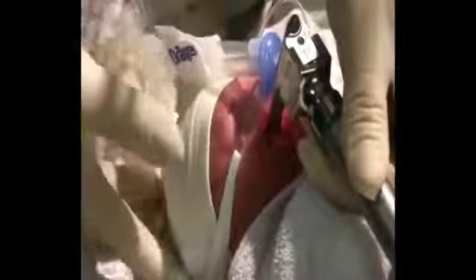This video demonstrates the application of surfactant to a spontaneously breathing infant. The gestational age of the infant was 28 weeks, and the video was recorded about 30 minutes after birth.